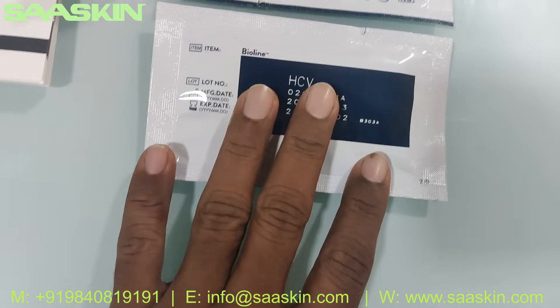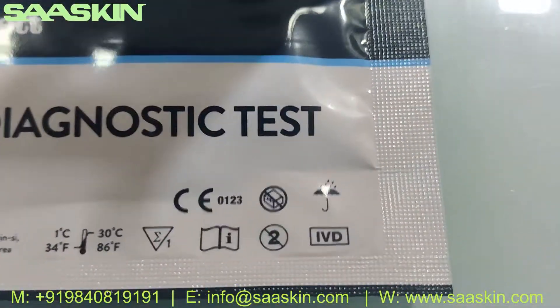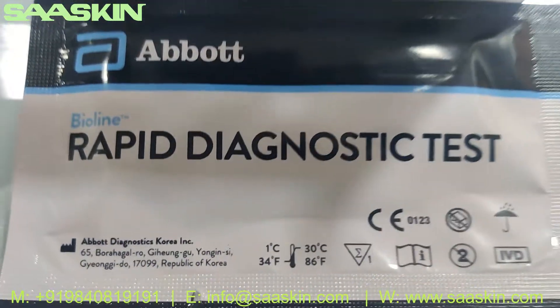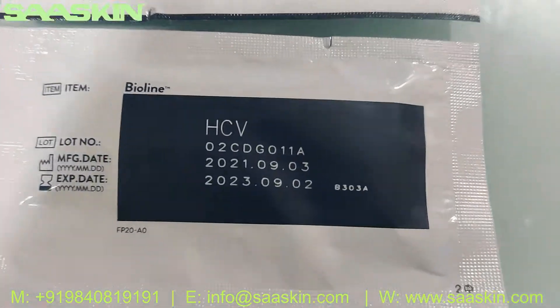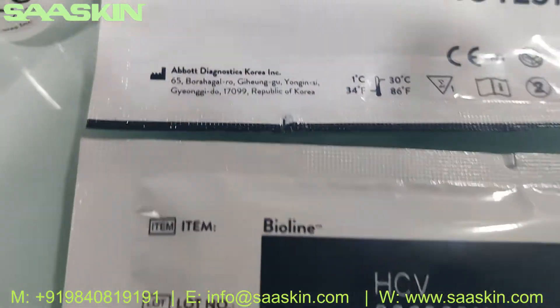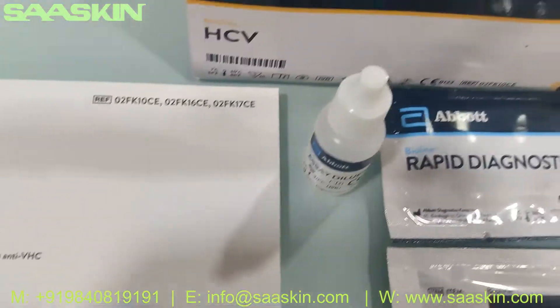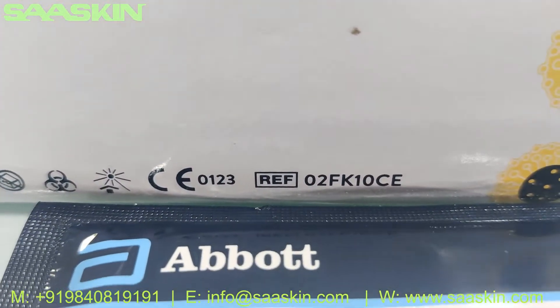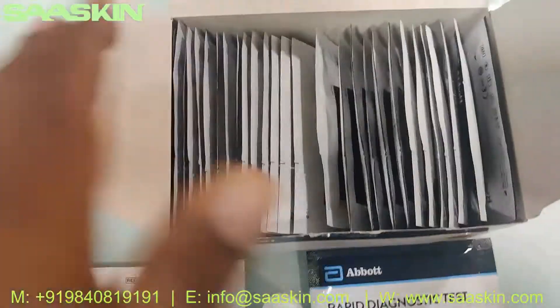Okay here it is, this is how the cassette looks like. You can see the two years of validity here, a lot number, and you get the part number here — you can see the part number on the box. So this is the total contents.